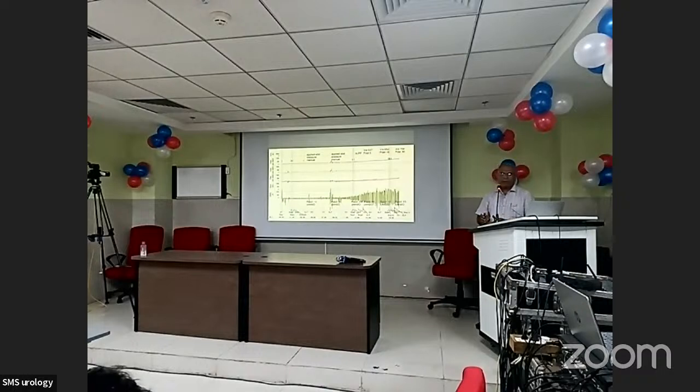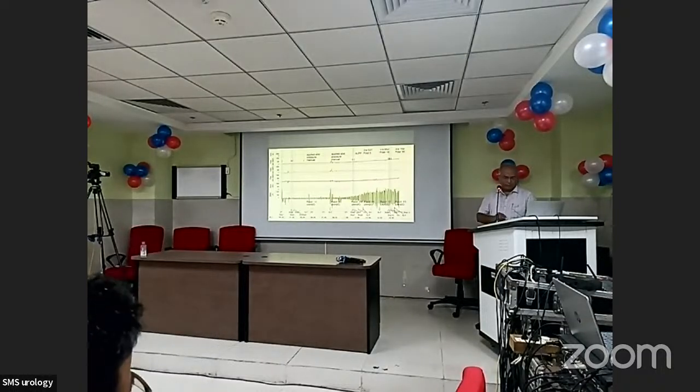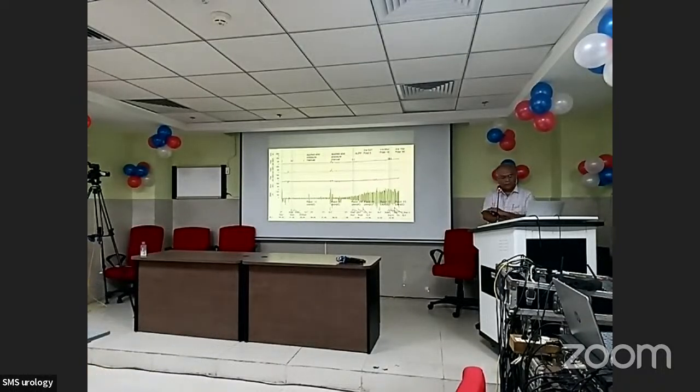This is something which we may see especially in spinal cord injury patients, in which there is exaggerated recruitment or guarding reflex. What happens is, when there is bladder filling, in response to that filling the EMG activity gradually increases, and it keeps on increasing because of recruitment. This we can appreciate in spinal cord injury patients, and this is the expected pathological response.